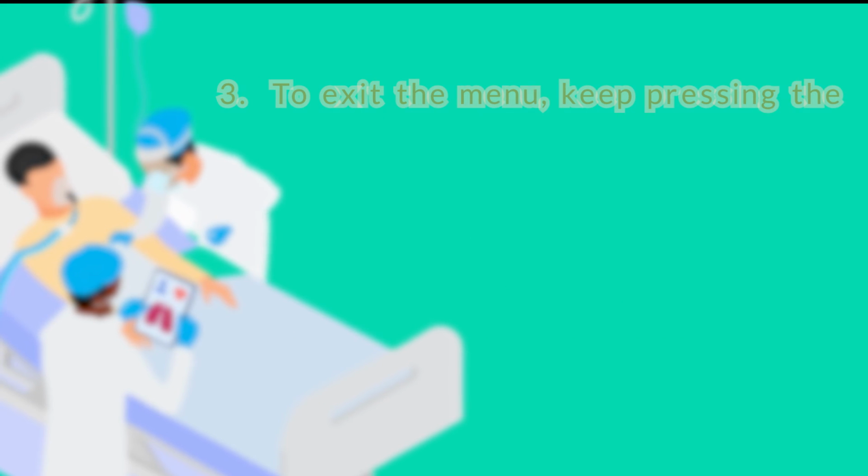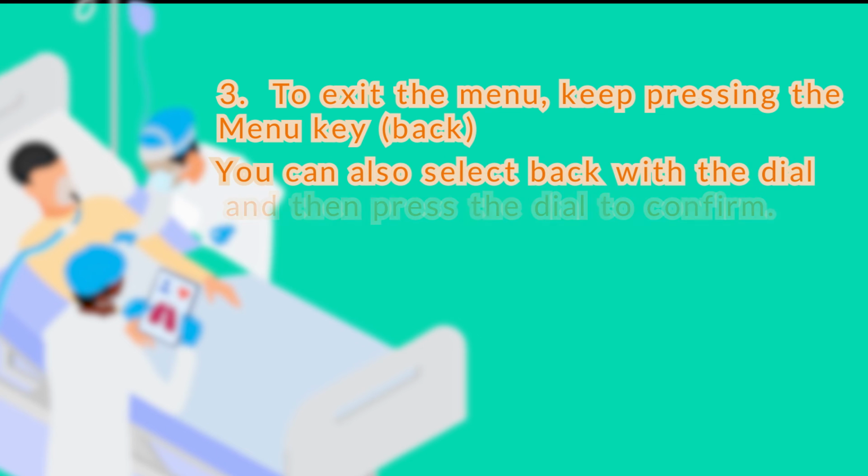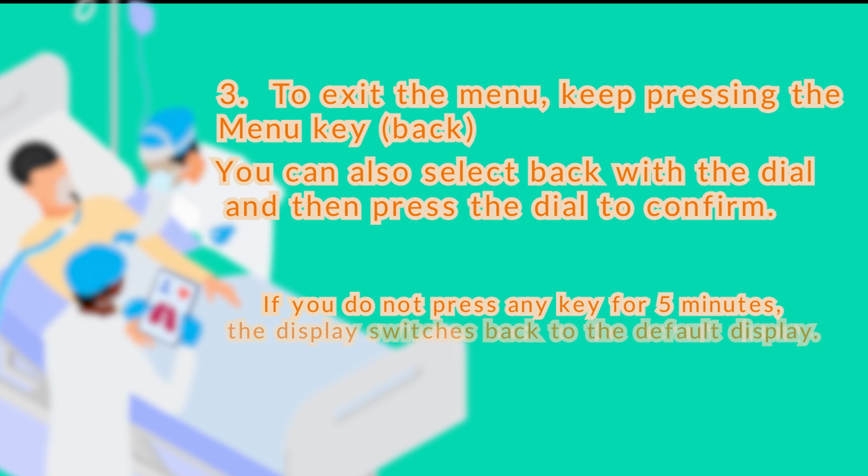3. To exit the menu, keep pressing the menu key back until the default display appears. You can also select back with the dial and then press the dial to confirm. If you do not press any key for 5 minutes, the display switches back to the default display.